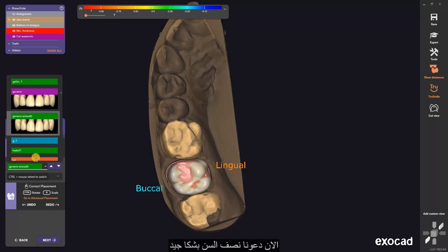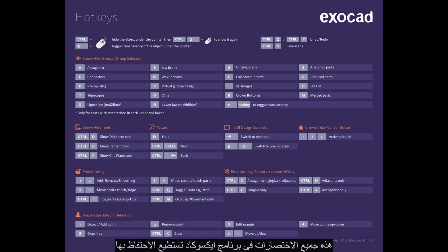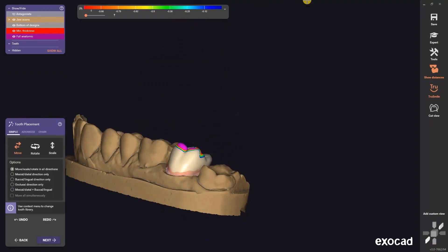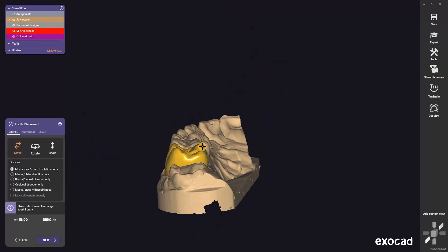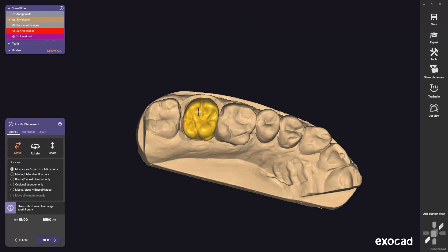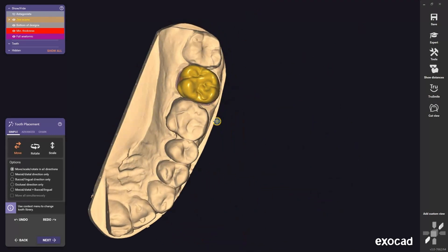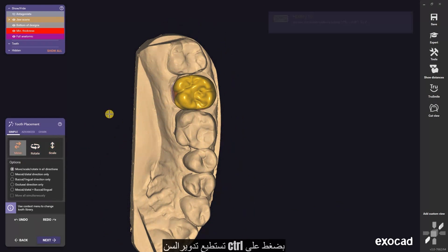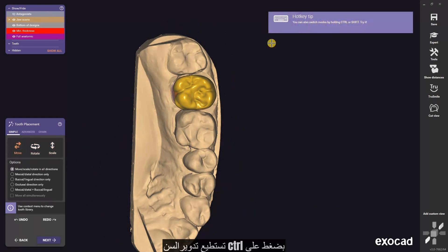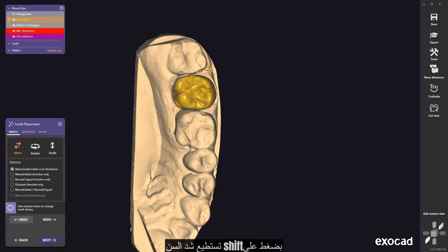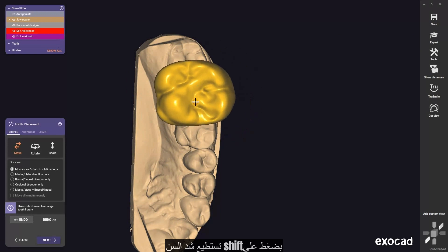Now let's make a good placement. Those are all the shortcuts in ExoCAD — you can save it on your device. By clicking CTRL, we can rotate our tooth. By clicking shift, we can scale our tooth.